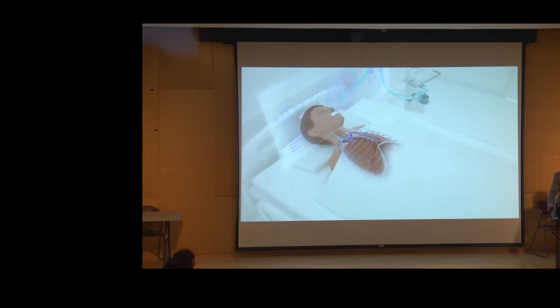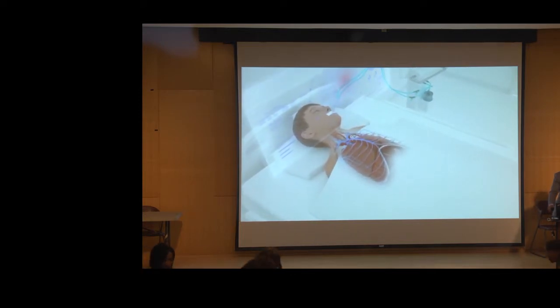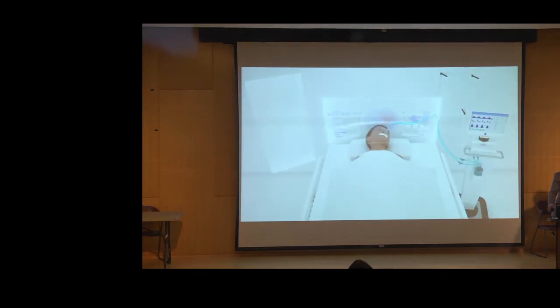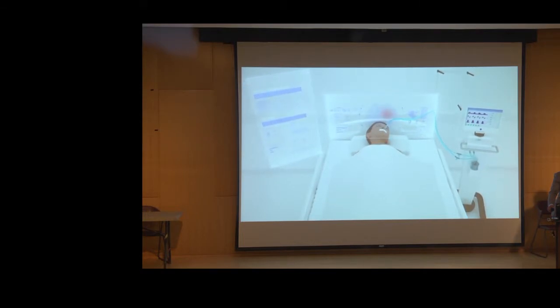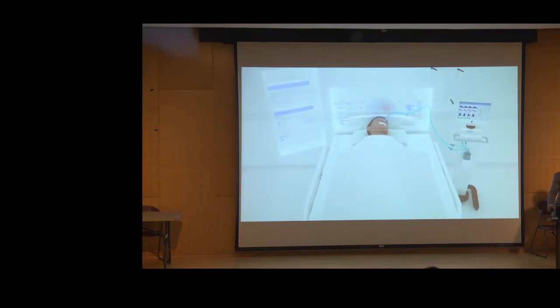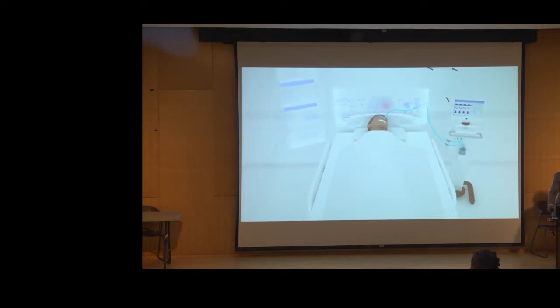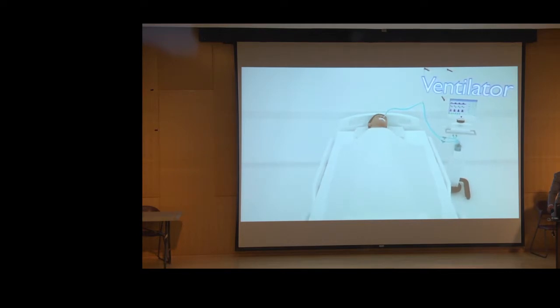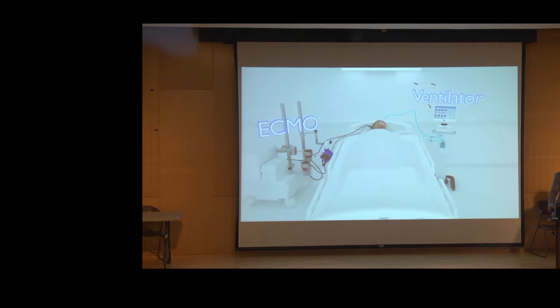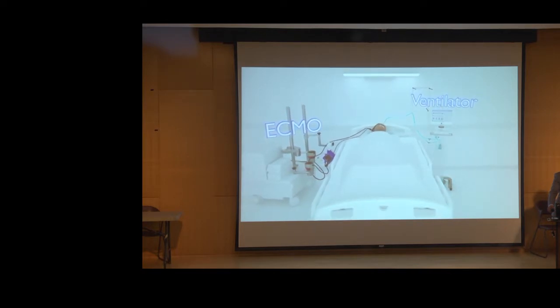When the ventilator finishes delivering a breath and the airway pressure drops, air is exhaled from the body and the lungs deflate. While this mechanical imitation of breathing can achieve the same goals as spontaneous breathing, it is not natural to our bodies and has its own side effects, especially at high pressures and oxygen concentrations. Although doctors don't exactly know at what settings a ventilator's side effects start to cause lung damage, they do know that an alternative treatment called ECMO can reduce injury caused by ventilators and foster lung healing in certain types of diseases.